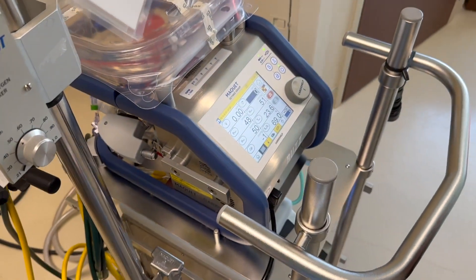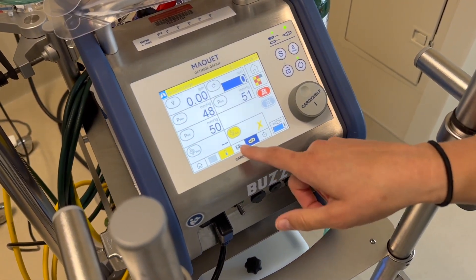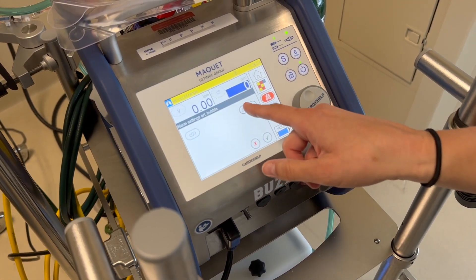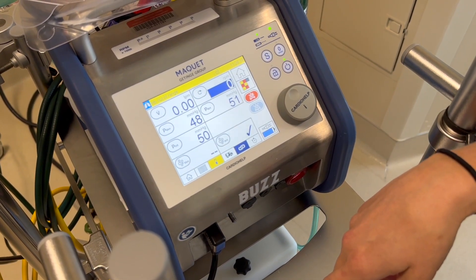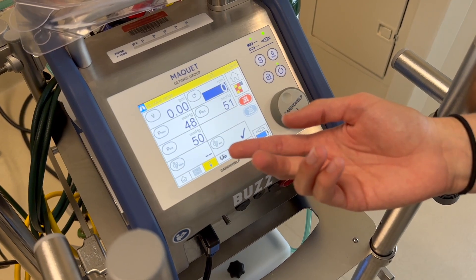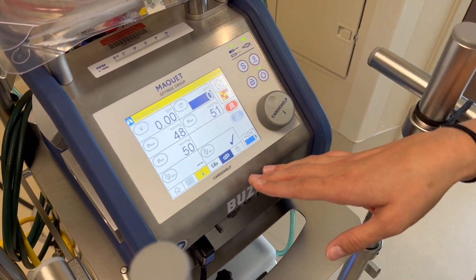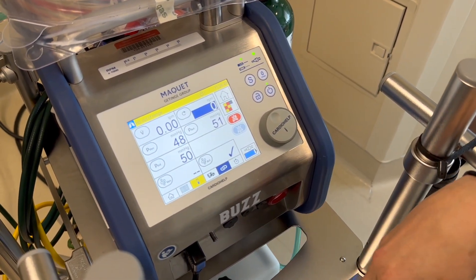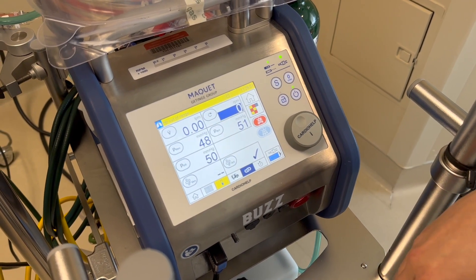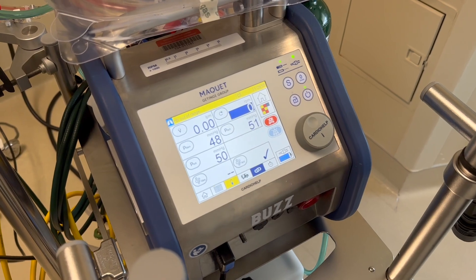Next, reset the bubble alarm: hit your chain link, hit your bubble, reset it, and hit check. Then deactivate your global override. If you're going right to OR, sometimes you wait to deactivate the global override so it doesn't alarm constantly while you're back there. But definitely before you place your patient on ECMO, you need to take your global override off. Then you're ready to go.